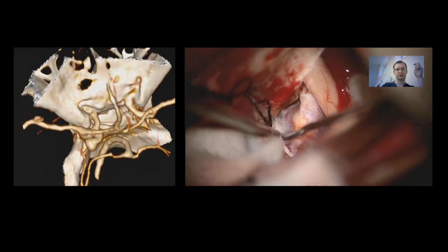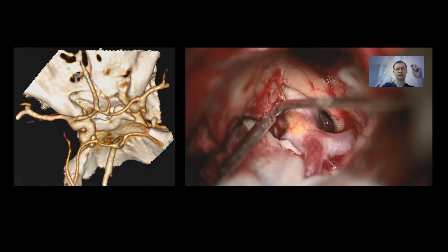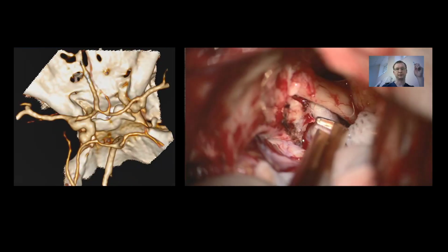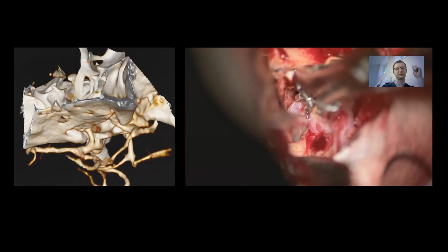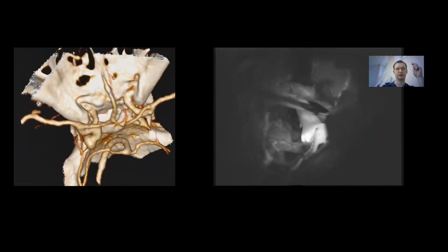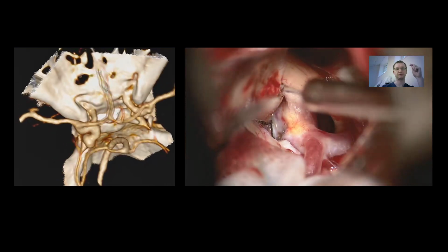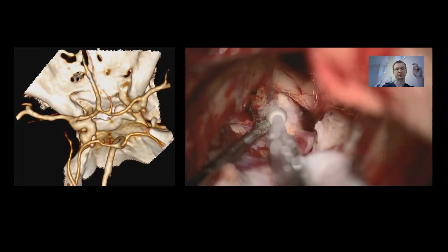All of you, I guess, use such simple, fast voxel reconstructions in your practice. As you can see here, this is CT angio. It is available in all modern DICOM viewers. It can be done with a few mouse clicks and allows you to significantly improve your preoperative understanding of the anatomical situation. For example, in this case, according to the 3D reconstruction, it was clear that the large anterior clinoid process would make clipping uncomfortable and its resection would be necessary.